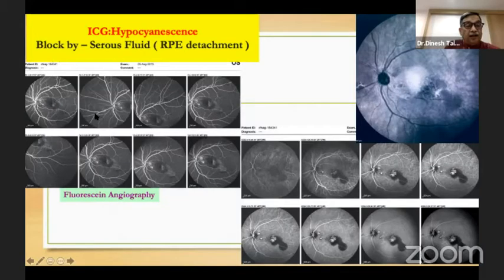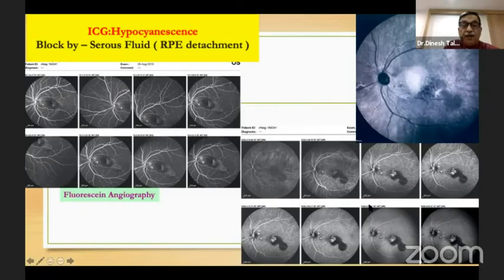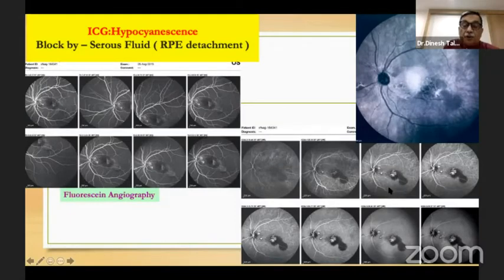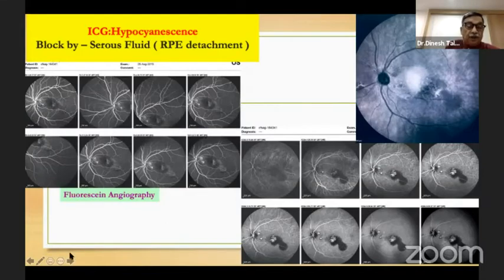The other eye shows an RPE detachment on the FA, and on the ICG you can see the area of the RPE detachment again shows hypercyanescence. And within this, you can see there is a plaque-like lesion which is also hypercyanescent.